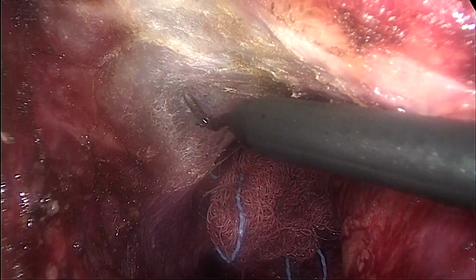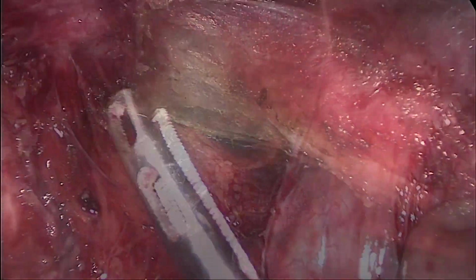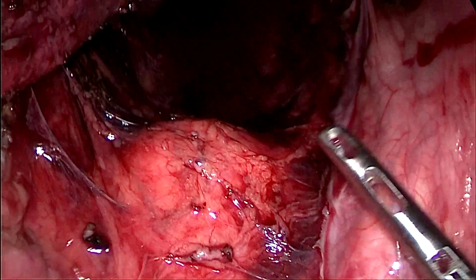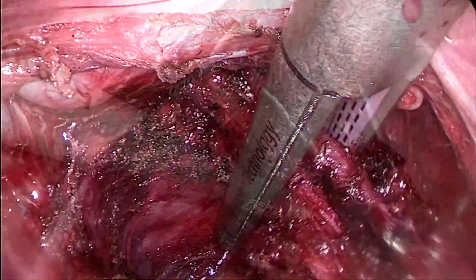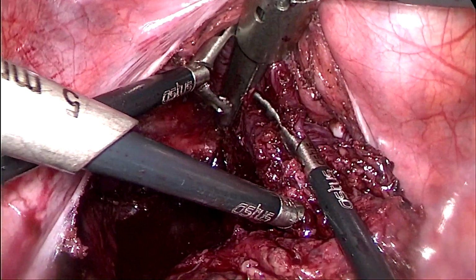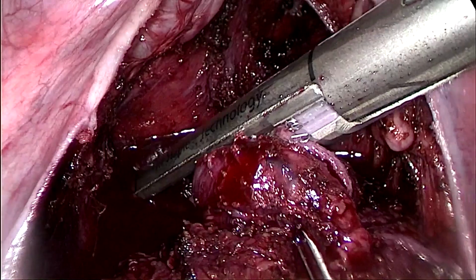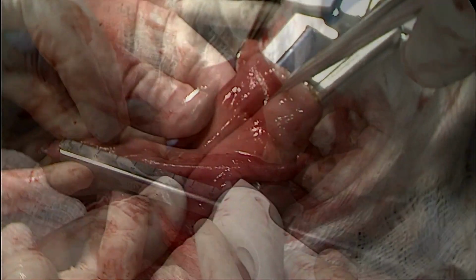So we're going to dissect the lateral, the left, and we finished. So now we're going to transect both the rectum distally and the ileum. So we are now resecting it. We're going to perform a Pfannenstiel incision. After we extract the specimen, we staple the terminal ileum.